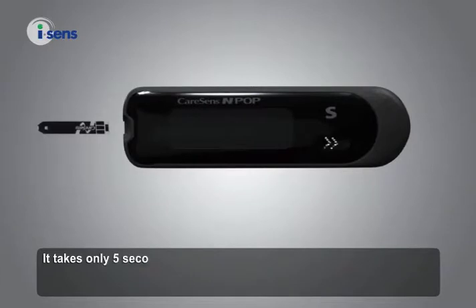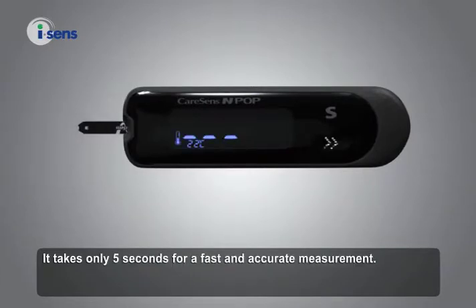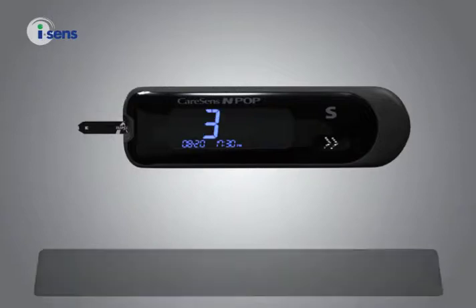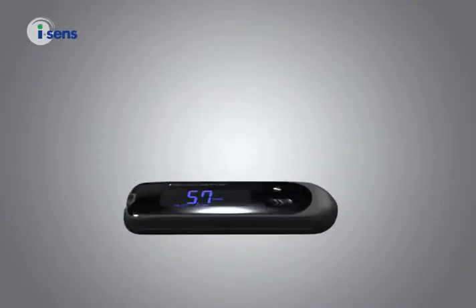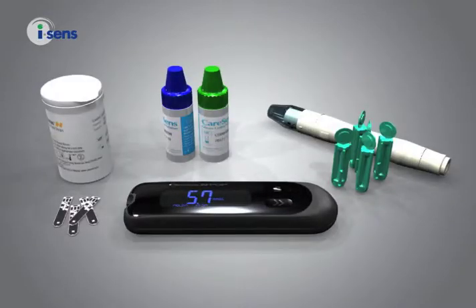It takes only 5 seconds for a fast and accurate measurement. Up to 500 test results can be automatically stored, and you can systematically manage your diabetes with the PC Care Blood Glucose Data Management software.